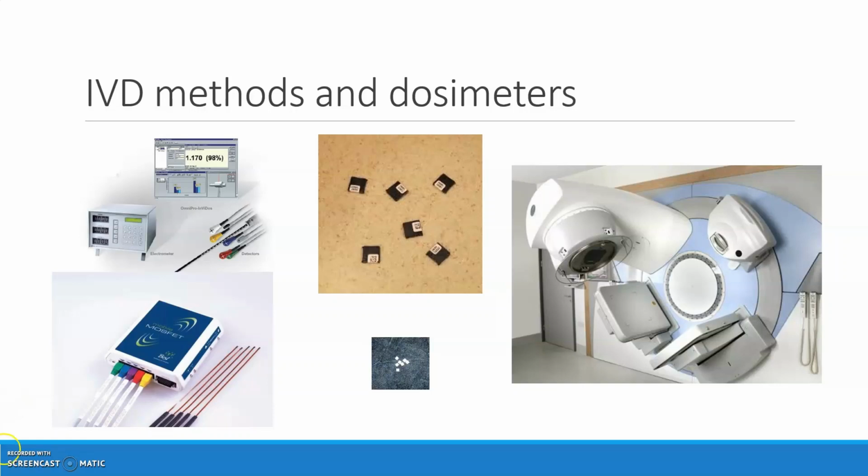So how can we check the dose that's been delivered? So what we have are two options really. We can have point dosimeters, or we can use something called transit dosimetry. So point dosimeters are, as we can see at the top here, semiconductor diodes. We can have things called MOSFETs, which stands for metal oxide silicon field effect transistors. I'll repeat that, metal oxide silicon field effect transistors. These aren't widely used. Semiconductor diodes are. Or we can use thermoluminescent dosimeters.